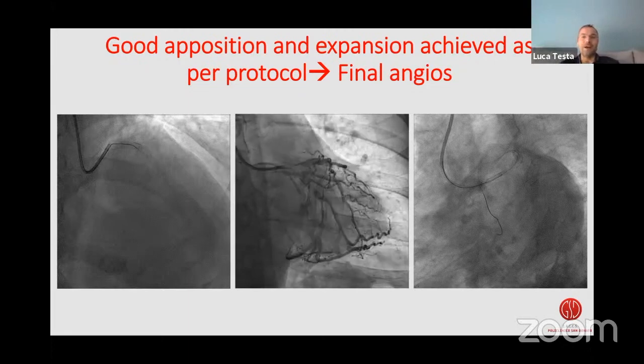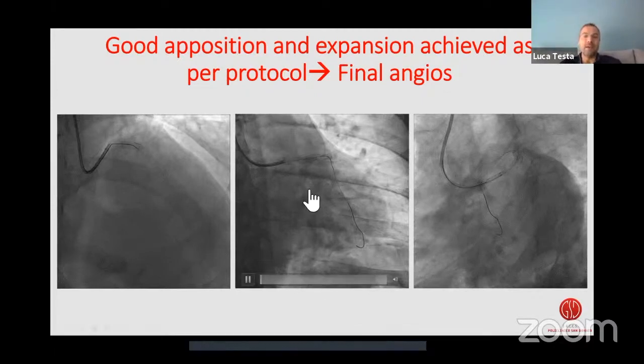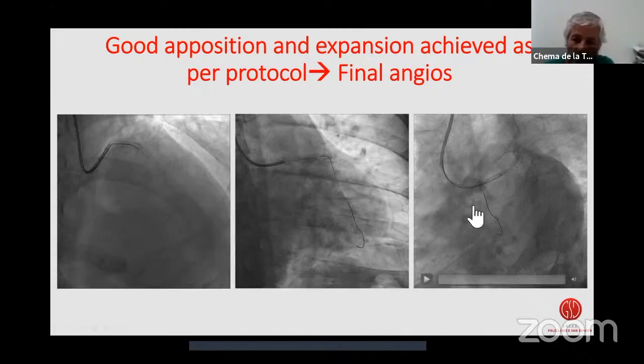Yeah. Indeed, I was actually in the mindset of getting out of the lab quickly, making sure that all the IVUS goals were met, and also I asked myself what to do next. Even if I take a bigger balloon, what is the point to achieve 8 and maybe I compromise the ostial LCX and then I have to put the stent on LCX? I said, look, best is the enemy of good, as you said, Adrian. Yes. And I think it's okay.